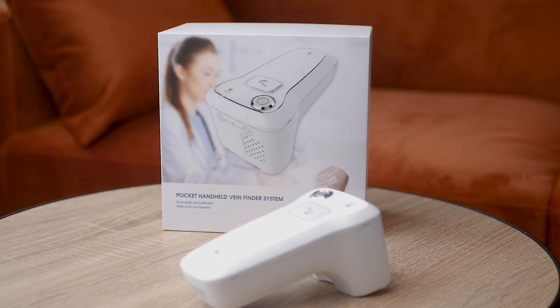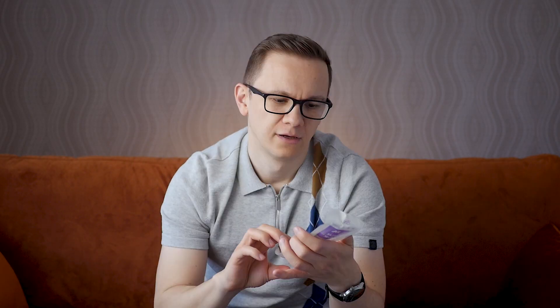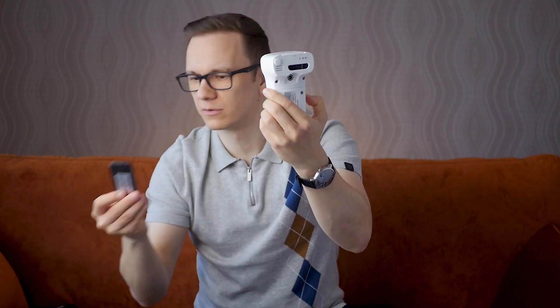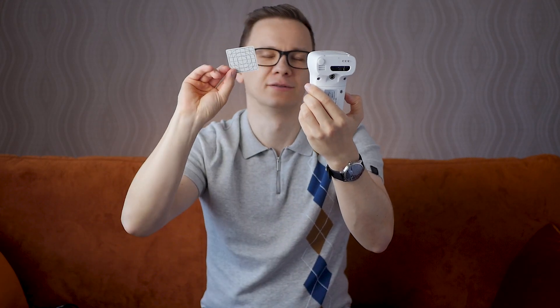The package says it's accurate and efficient, safe and convenient. Of course, why not? So let's see what the package contains: a skin marker, user manual, power cables, and the device itself. There are two more things here — a remote controller, and I guess a puzzle — no, I think it's for standardizing the device.